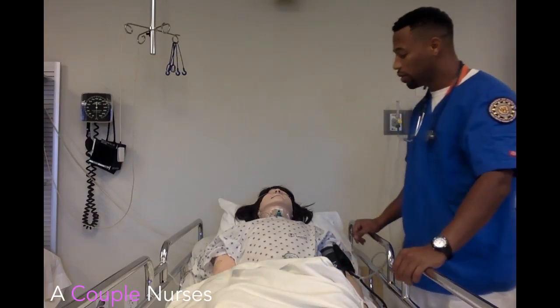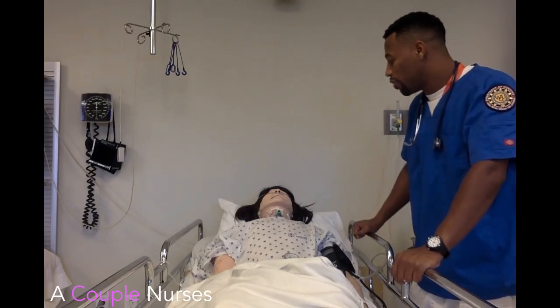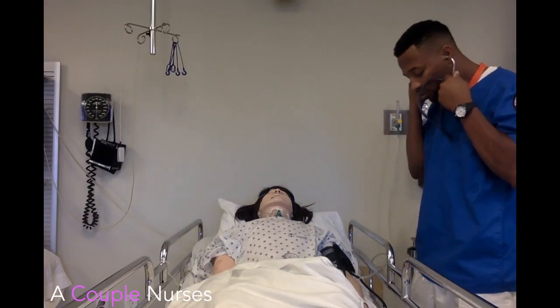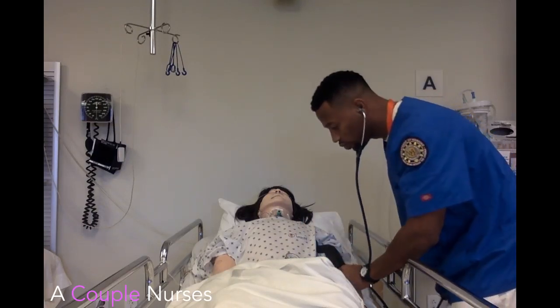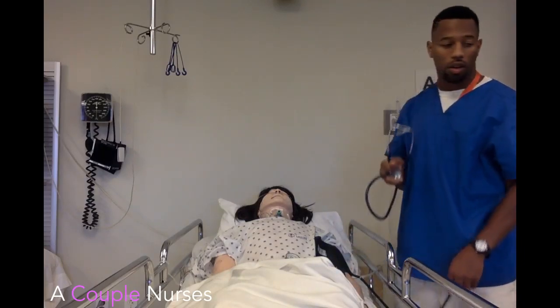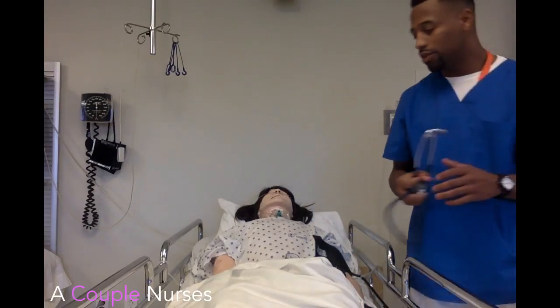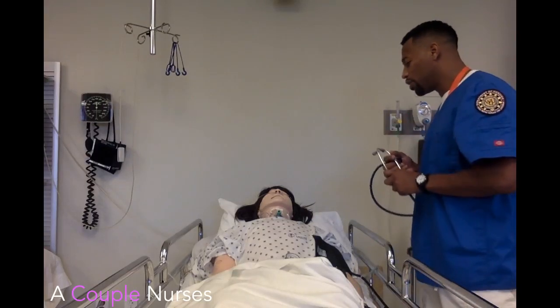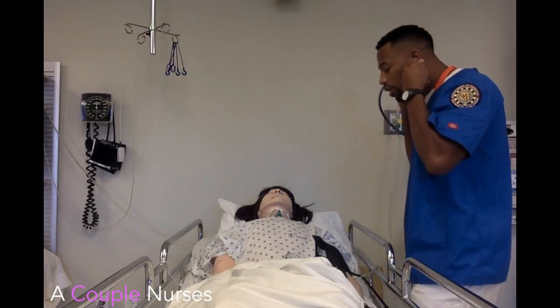Okay, we got a respiration rate of about 18 per minute, followed by a pulse of about 88. Let me get your blood pressure. Okay, blood pressure is about 115 over 72, which is pretty good. Have you had any problems breathing? A little bit hard to breathe? Okay, well let me listen to your breath sounds and your heart.